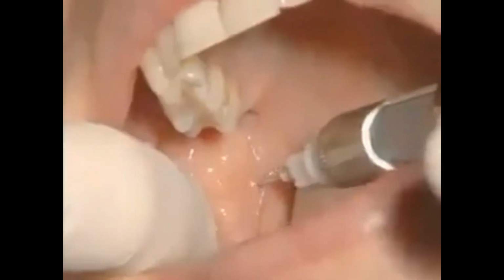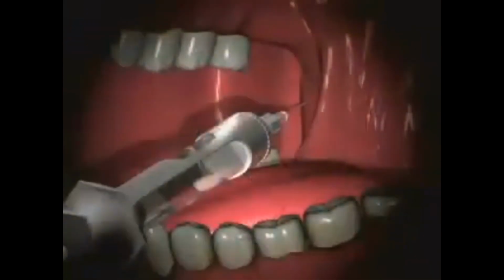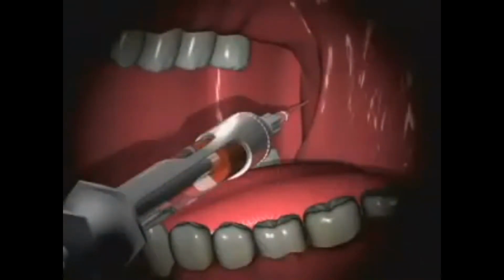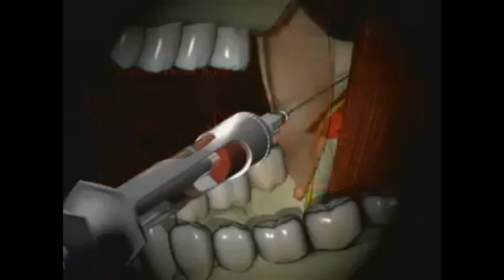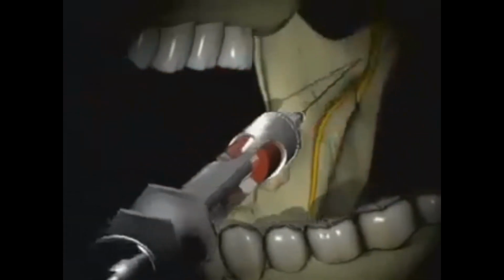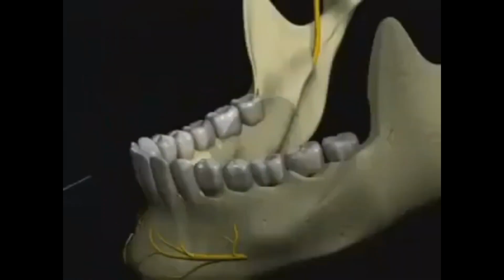Once bone is hit, you withdraw slightly, you aspirate, and slowly begin to inject a full cartridge of local anesthetic, unless you are following with a buccal nerve block, in which case you should inject 3/4 of the cartridge. The needle is now passing through mucosa, a thin portion of buccinator muscle, loose connective tissue, and adipose tissue. It lies lateral to the medial pterygoid muscle and the sphenomandibular ligament, and medial to the ramus of the mandible.